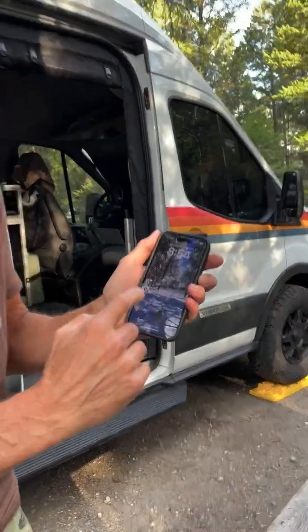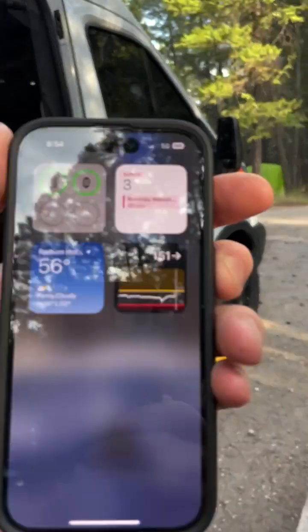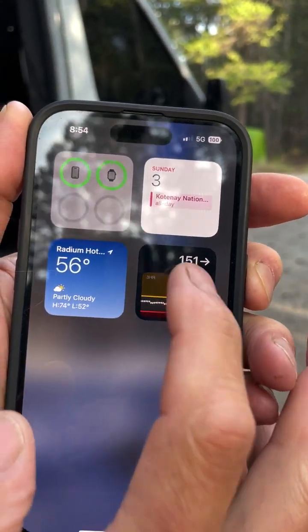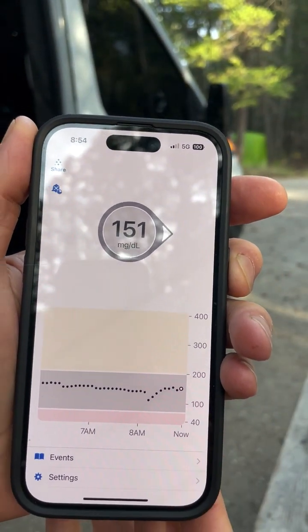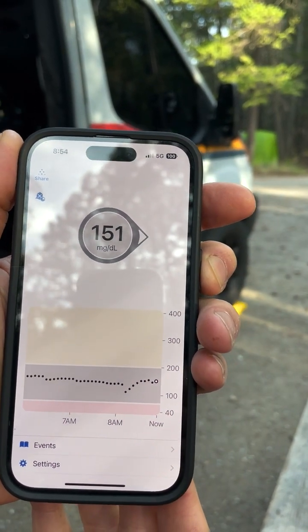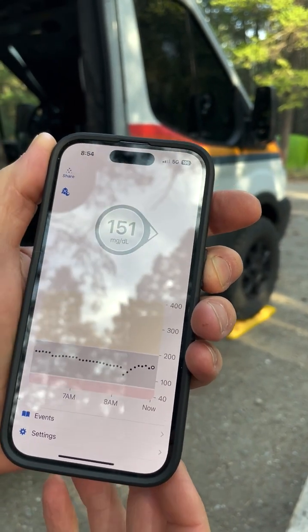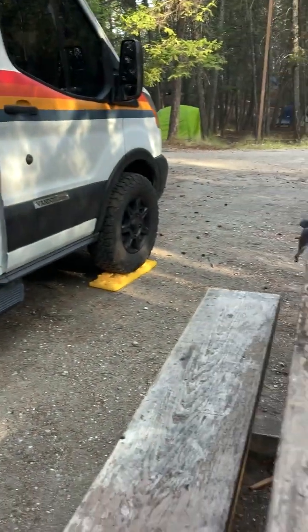I have my Dexcom hooked up to my phone. If I turn my phone on and swipe right, that's my Dexcom — that's what my glucose value is right now. It's usually a little higher in the morning. I probably need to adjust that so I get more insulin just before I wake up, but I'm at 151 right now.